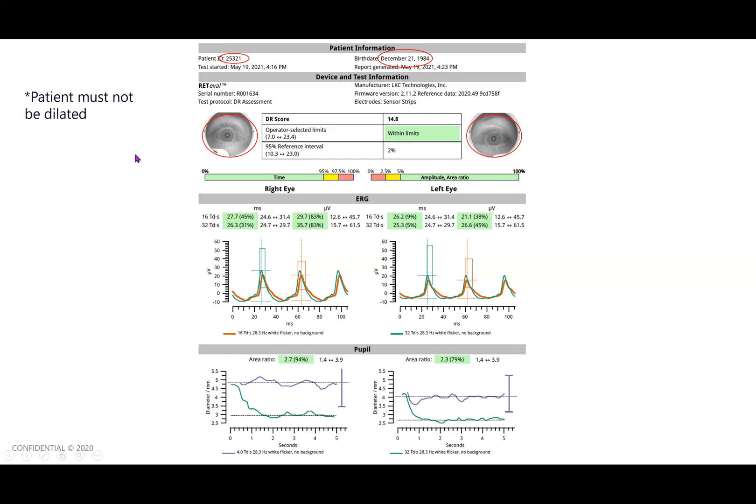This report can be as easy as you want it to be, or you can dig into the details. If you're interested in just a quick number telling you, is this patient at risk or not at risk, you can look at the DR score. In this particular case, 14.8, that's well within the limits of the Briegel study of 7 to 23.4. If you want to compare it to the normative database, you can see in the second percentile, so way down at the bottom of the DR score range. And remember, the lower the DR score, the better.